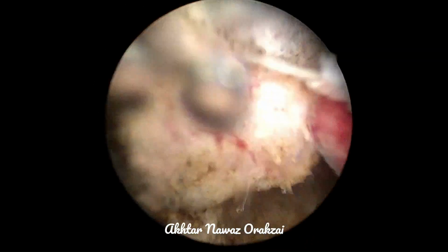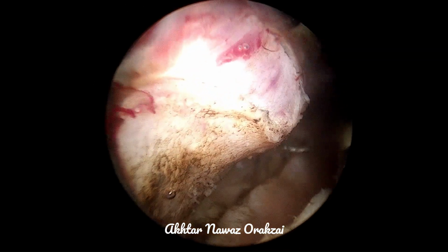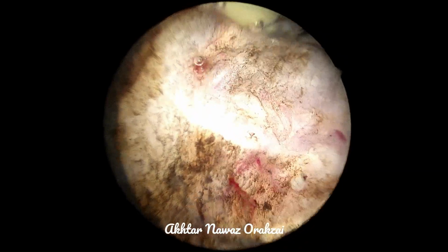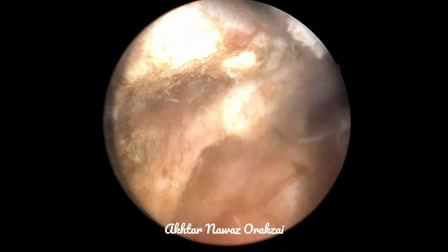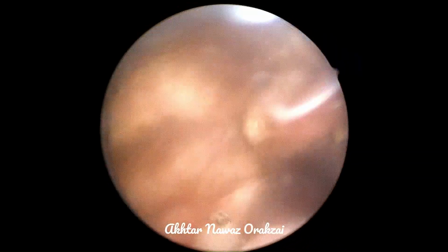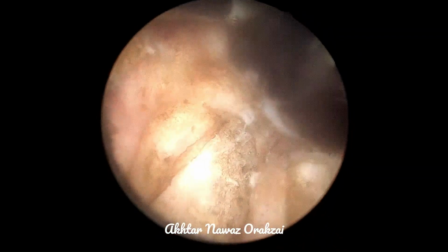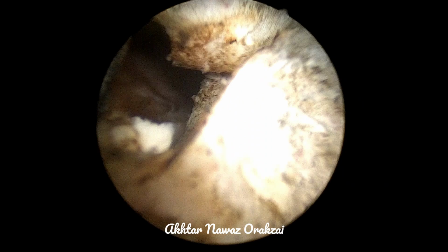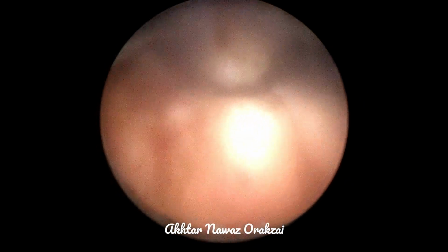Now you will see that I'm taking deeper and larger chips at the beginning, but later in the procedure I'll take shallow chips. We'll show that when we discuss that. Here I'm taking deeper and bigger chips, and we are resecting systematically.